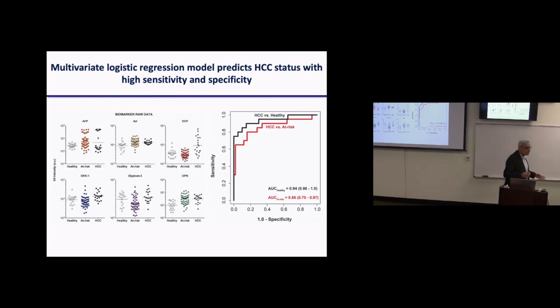And you get an ROC, an area under the curve, where 100% sensitivity and specificity would be a rectangle, and flipping a coin is a diagonal. So you don't want a diagonal, you want to be as close to a square wave function, is the way to explain it. And that gives you the area under the curve. You want a high area under the curve. So we got AUCs of 0.94 and 0.86 for these samples.